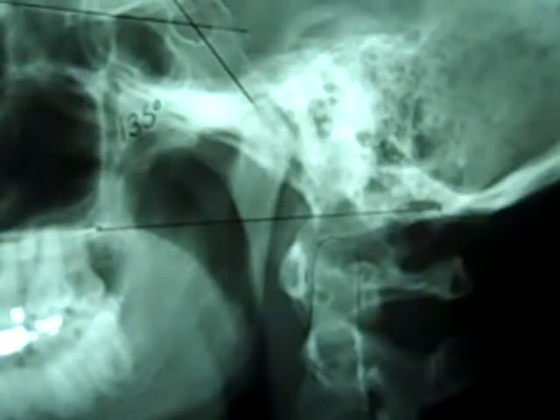I've drawn in the odontoid process, so you see in this case it's not any above the line, so nothing to worry about. But if it were abnormal, we would not want the dens to be more than 3 millimeters. We do not want to see more than 3 millimeters of the dens above the line. If you do see more than 3 for Chamberlain's, you need to be worried about platybasia and or basilar impression.